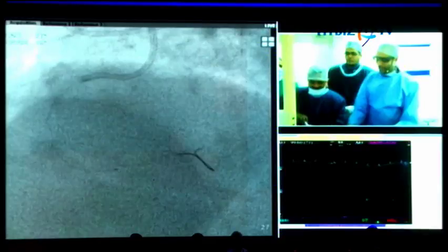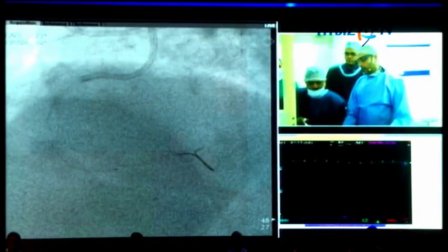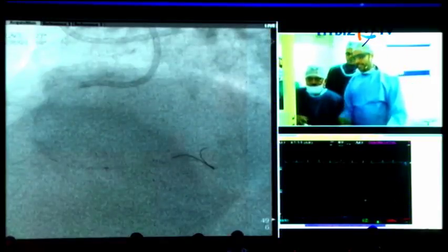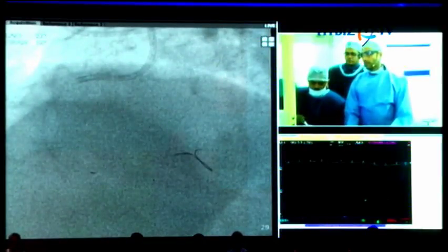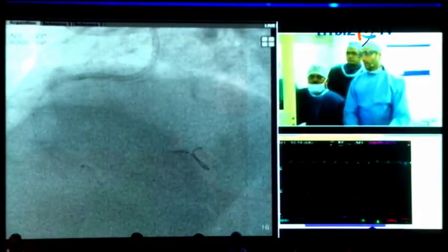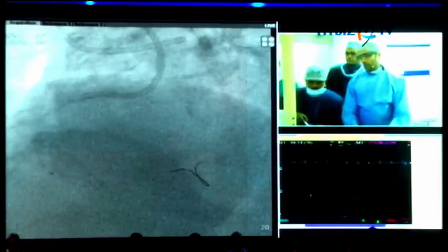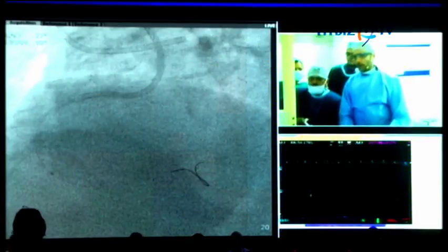Go up 20. Hey, Arun, can you hear me? Sudhir here, Sudhir Rathore. Hi, Sudhir. Obviously, it looks like quite a tricky case, and it might be subintimal at that point, so I think we should have a low threshold of considering retrograde, and assessing maybe it's caused more subintimal injury. Retrograde might be difficult. Let's see what it does. After ballooning, retrograde injection is not going to be great because I would have probably opened up the channels.